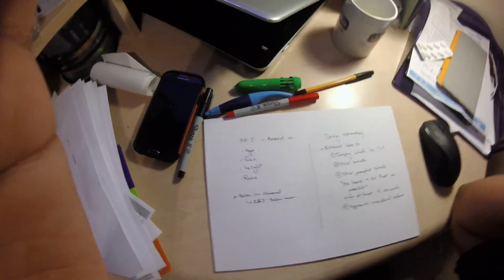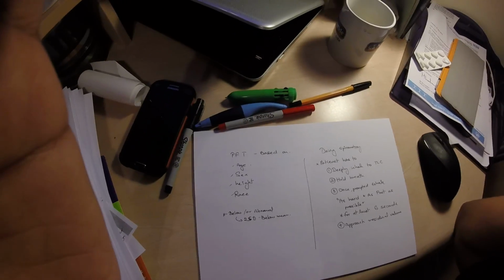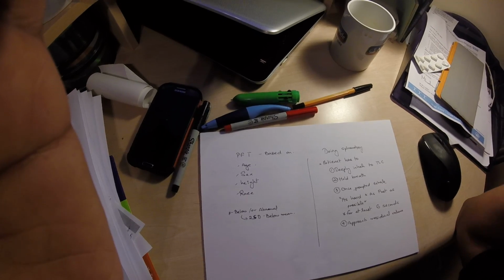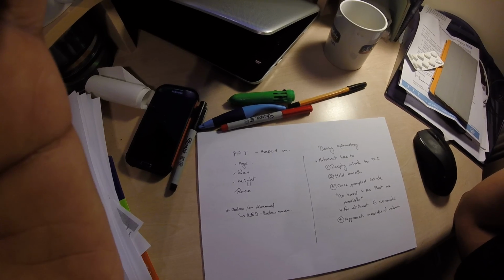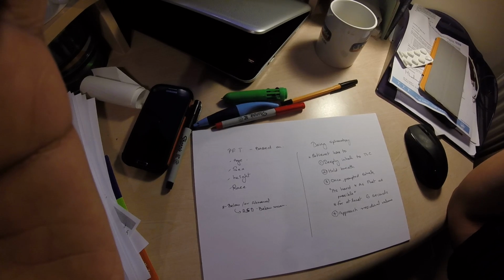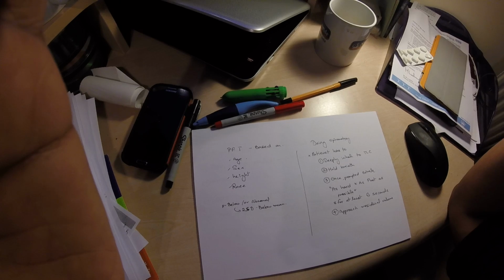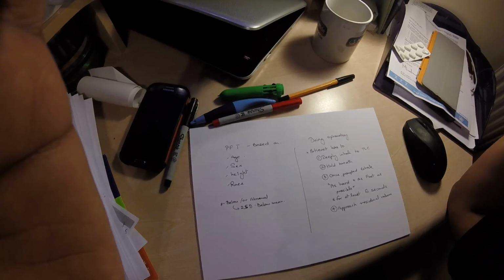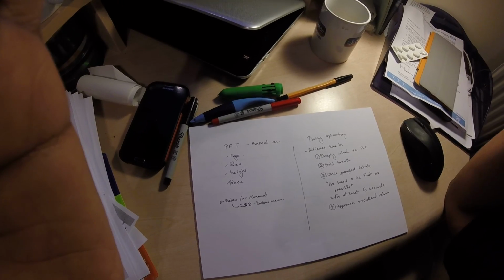Right, this is the basic description of what I understand by pulmonary function tests. Pulmonary function tests are a bunch of tests that basically help estimate or measure how well the lungs are able to release air from the lung. It also helps us estimate how quickly a patient can move gases through their lung, which also correlates with how much oxygen they can absorb from the atmosphere.